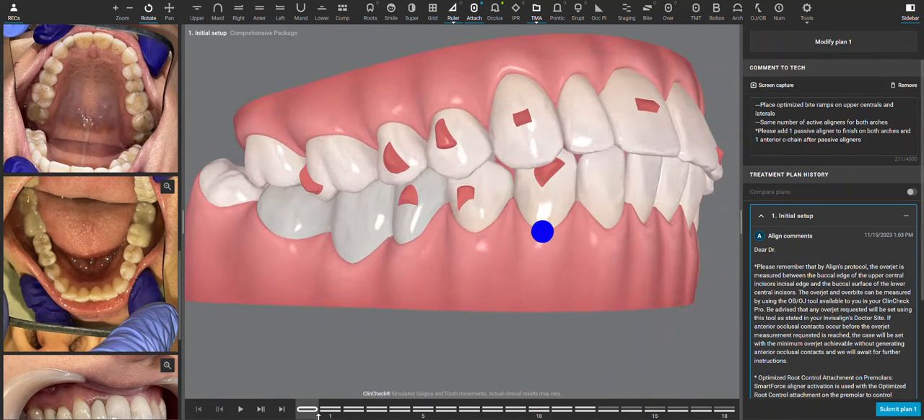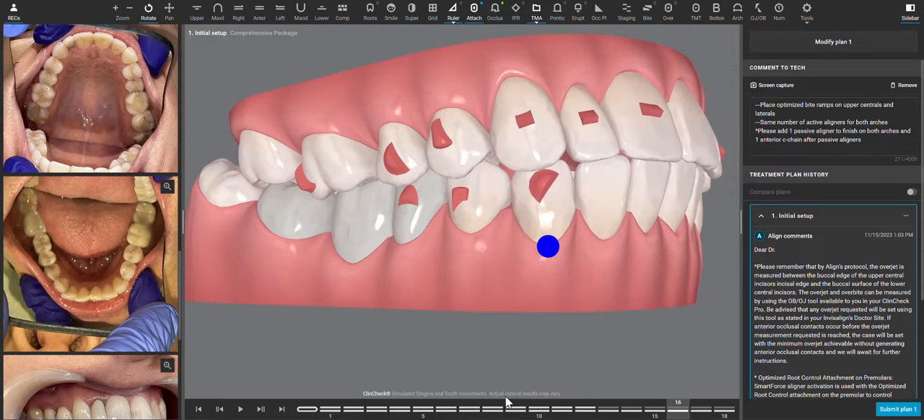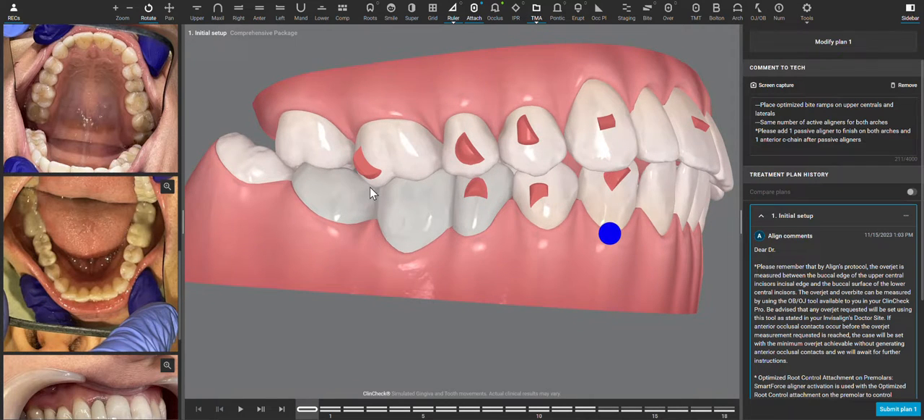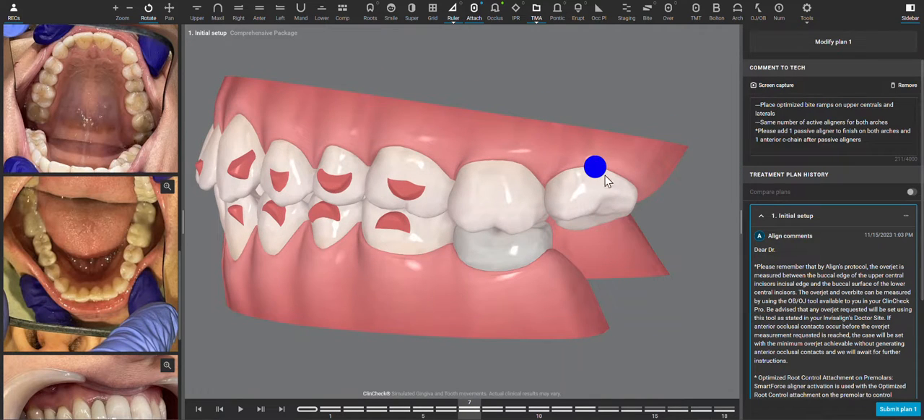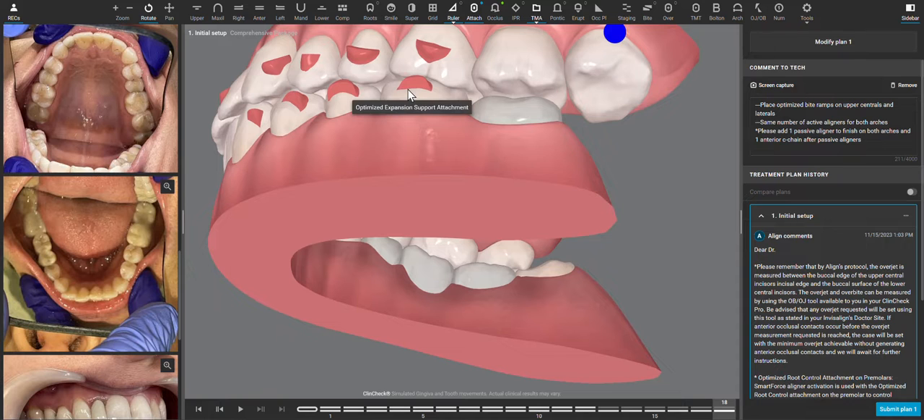I'm going to show it with the 3D controls. The initial ClinCheck is just from the Invisalign software, and I don't want to do these molar movements. The arch is sufficiently wide. Moving a third molar is really not realistic, and these molars are either going to not move at all or move in a way that is very easily a posterior open bite.